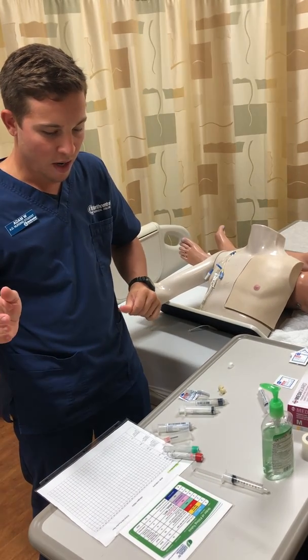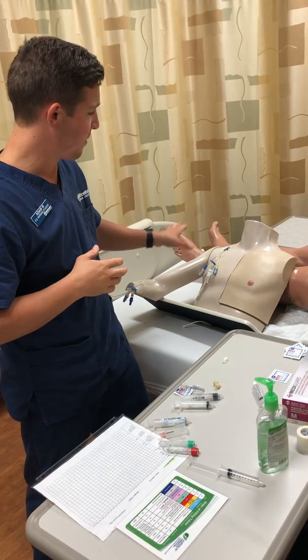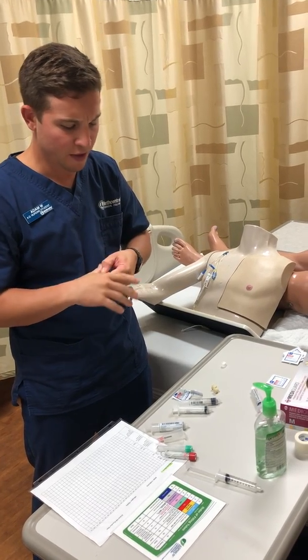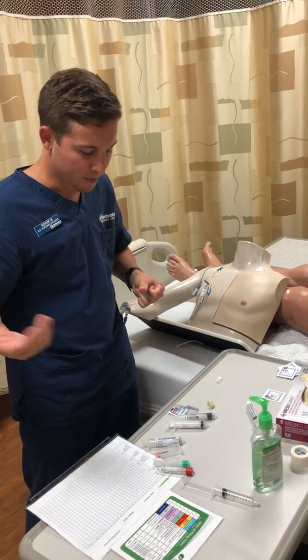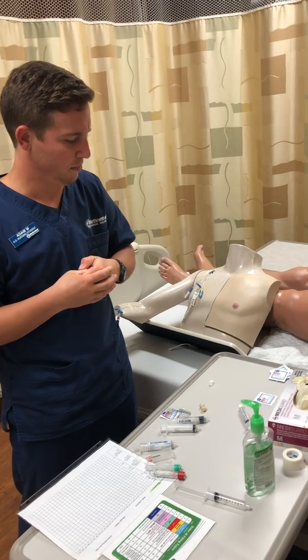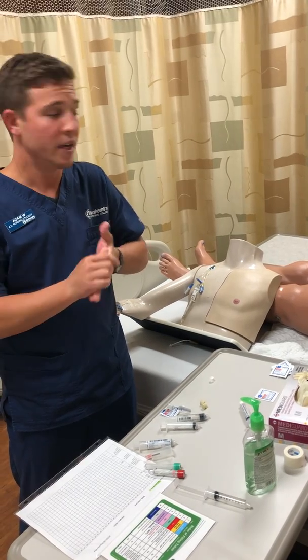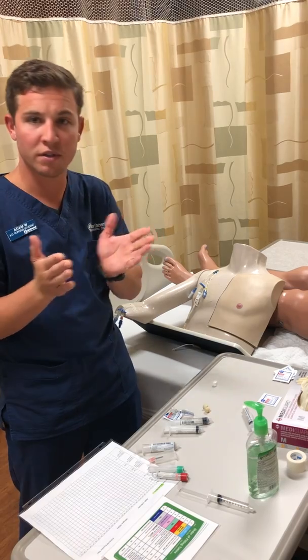And then I would be documenting an assessment of my site, which is important. We had everything that we needed for our lab. I already said lifespan consideration. So we would continue our fluids again as ordered, and this concludes my video.